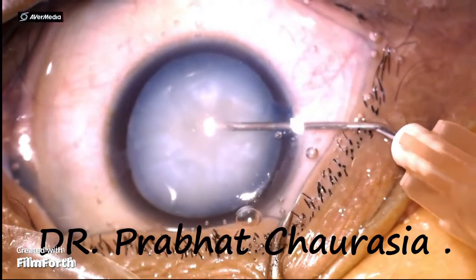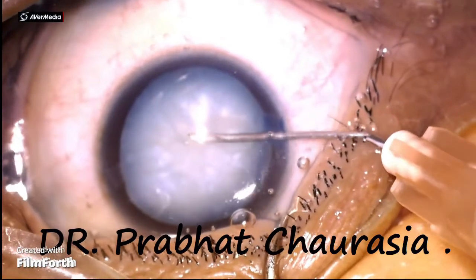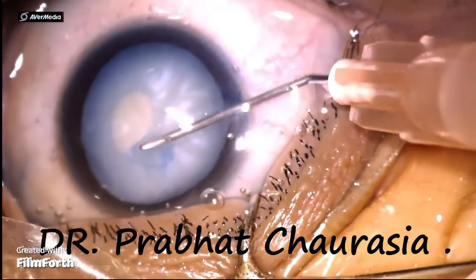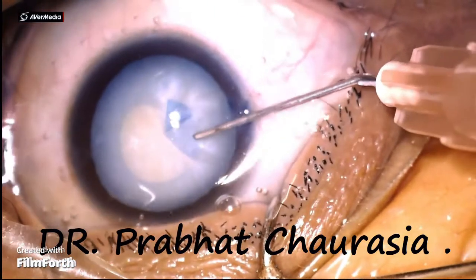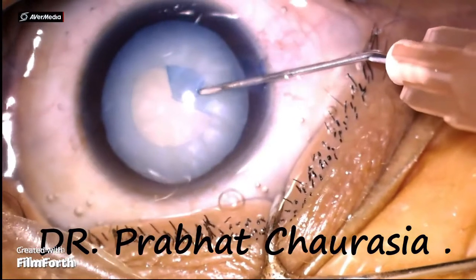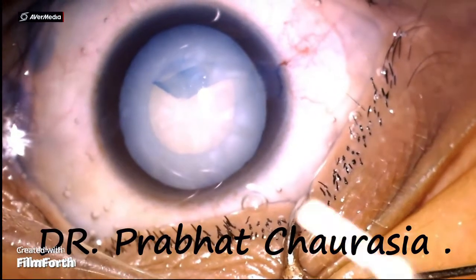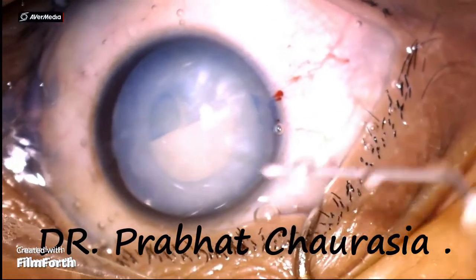Now the left-sided side port is prepared. Now I make a cystitome and do the rhexis. I am making a rhexis of small size. As I entered and pierced the capsule, some paltaceous material came out that is obstructing my visual field. See how I am making this rhexis — it is almost a continuous curvilinear capsular rhexis of a small size.